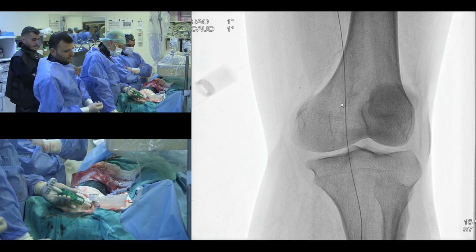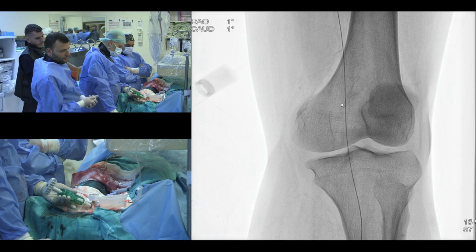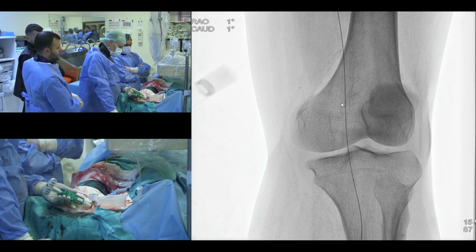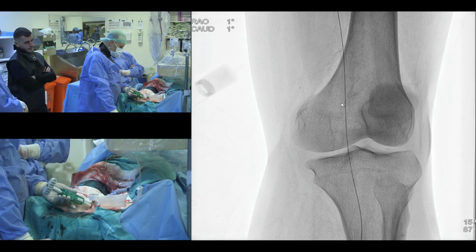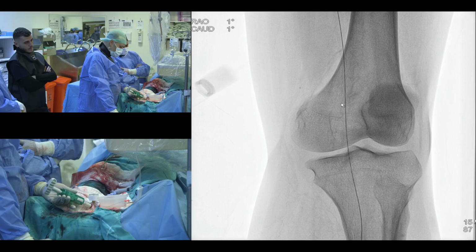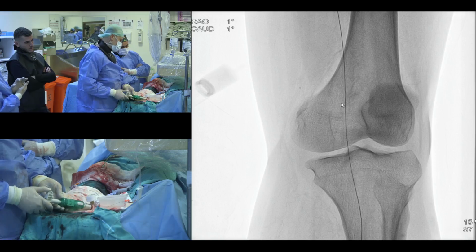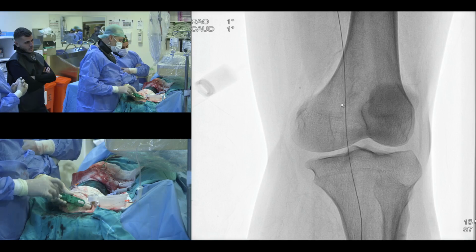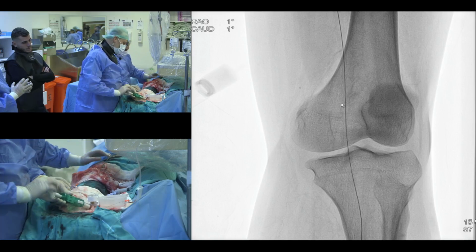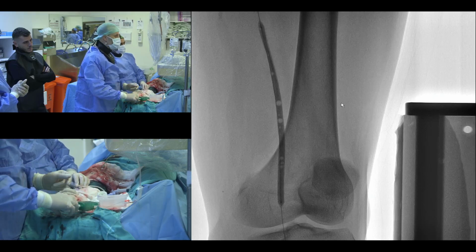Before the procedure, we checked the distal leg with ultrasound available here. Serhan and I together looked at whether we could have a retrograde approach or not, but we were not able to see the distal architecture in the foot. So now we will have an antegrade approach by chance. If we are able to cross something, then we will try to do our best.